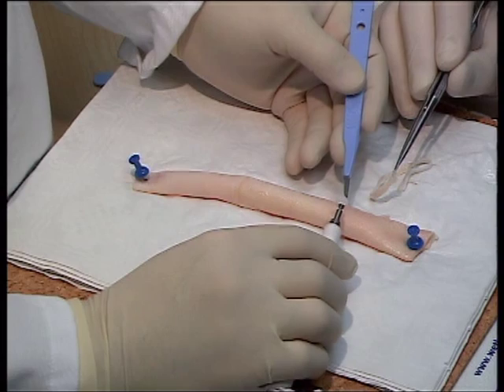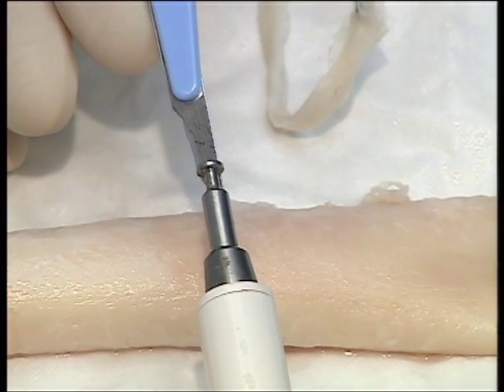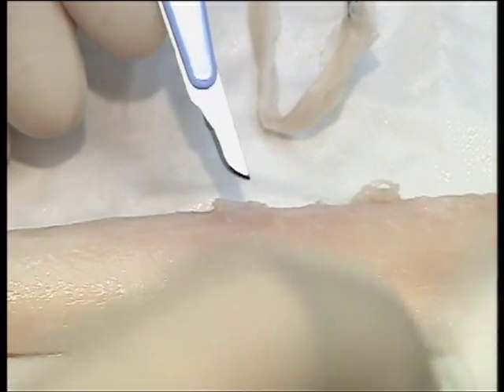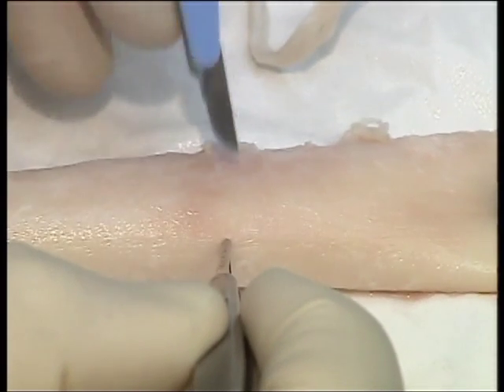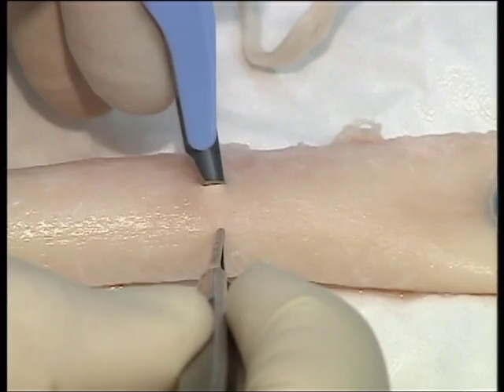To make a hole in the aorta, use a 15-bladed knife which is the same diameter as a 4mm aortic punch. Make a single stab incision in the aortic wall.